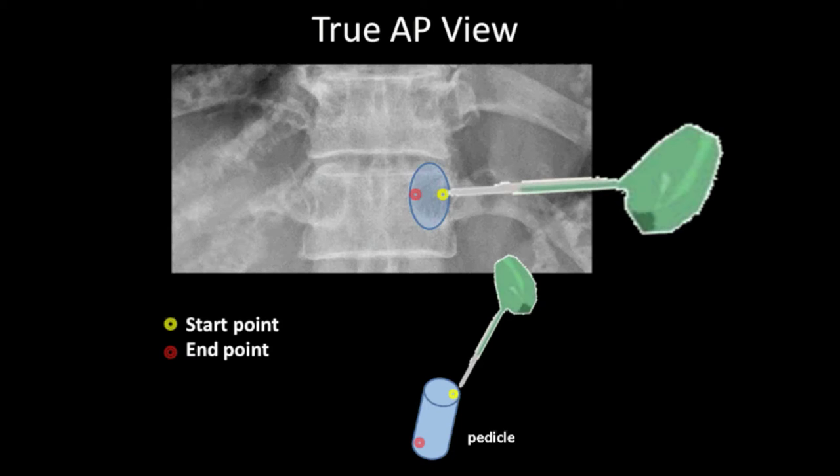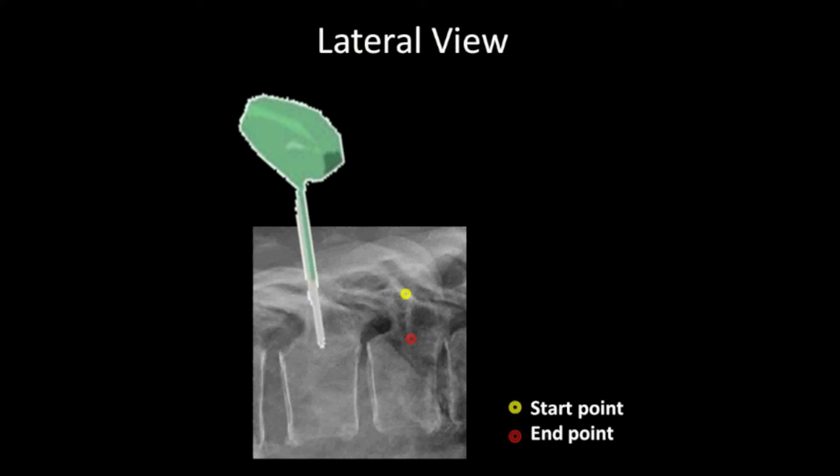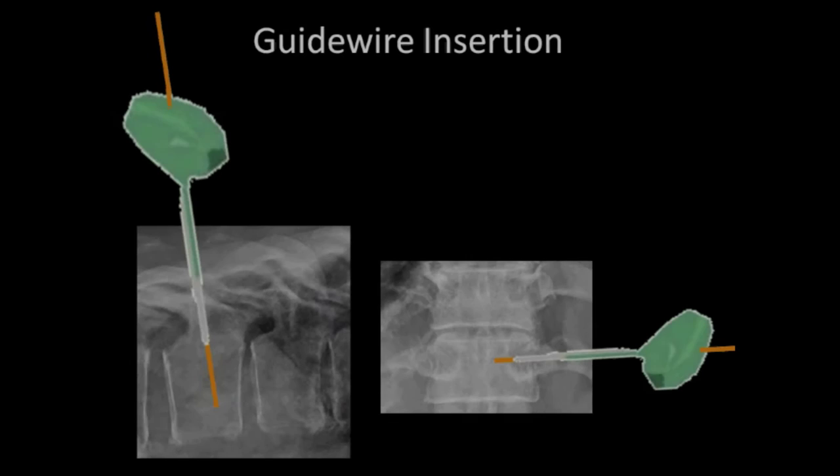A Jamshidi needle was advanced from the starting point to the end point, approximately 2.5 cm or one inch. Once the needle was advanced one inch into the pedicle, a lateral fluoroscopy view was obtained to check the depth of the needle tip.